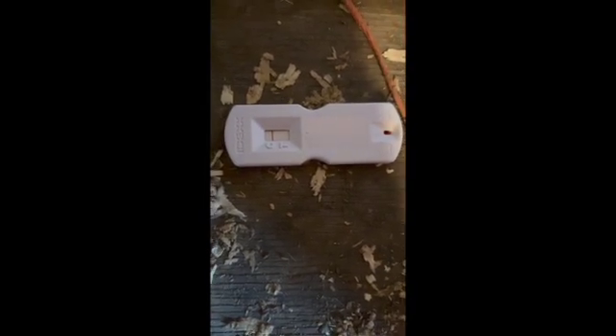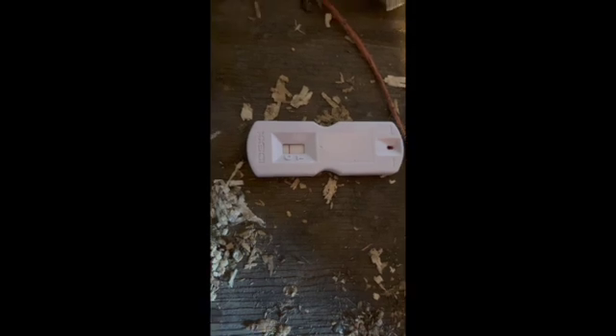It's been 10 minutes and it's looking like not pregnant, but I've got to leave it for another 10 minutes. I'm disappointed because I thought she was pregnant.